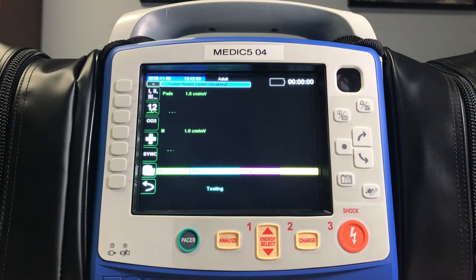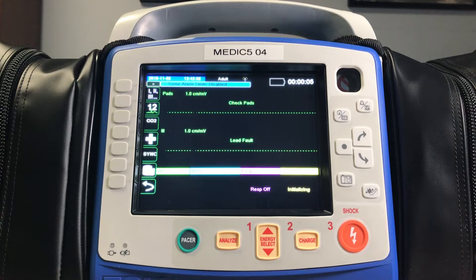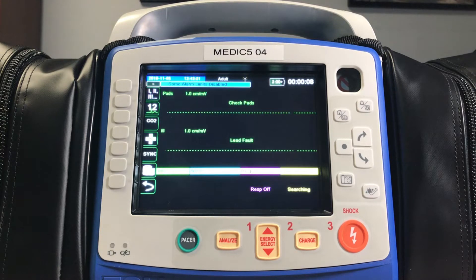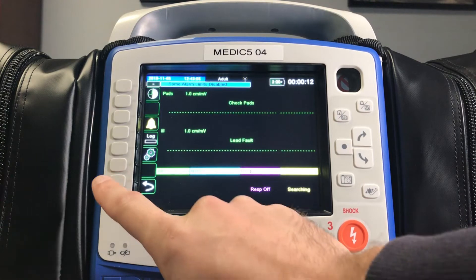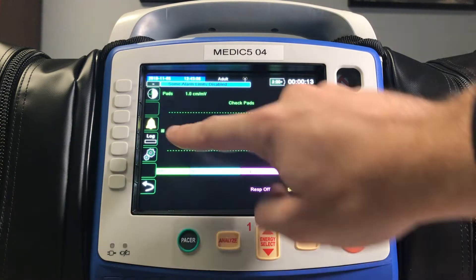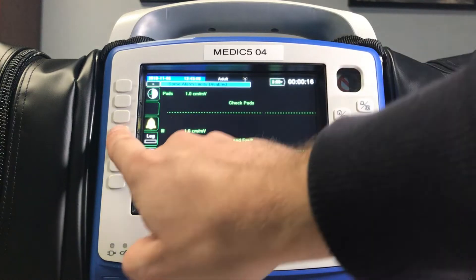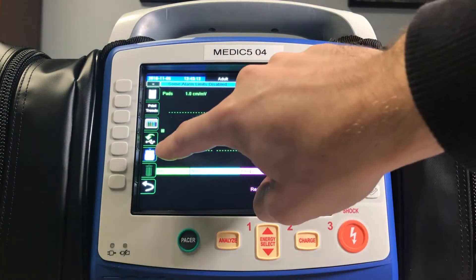Next, we're going to look down to the lower left of the screen and go ahead and push the button that flips your soft keys to the second set of options. On here, you'll see the log button on the left side. You'll push the button associated with the log, which will bring up options regarding patient data.